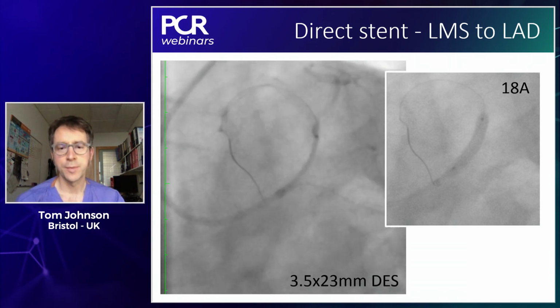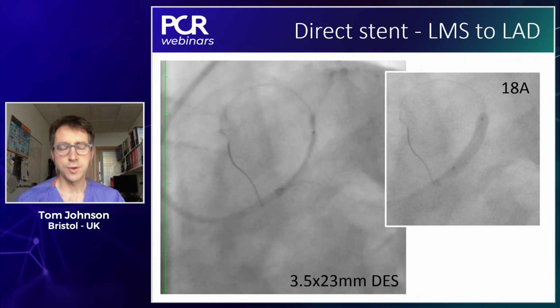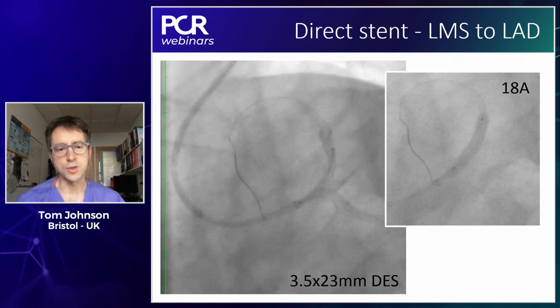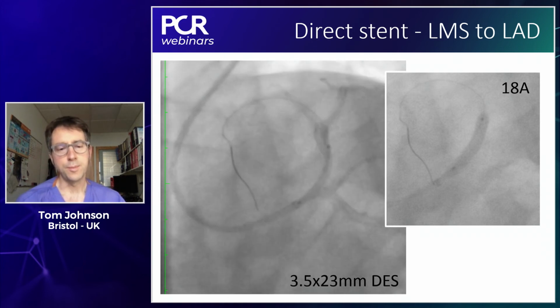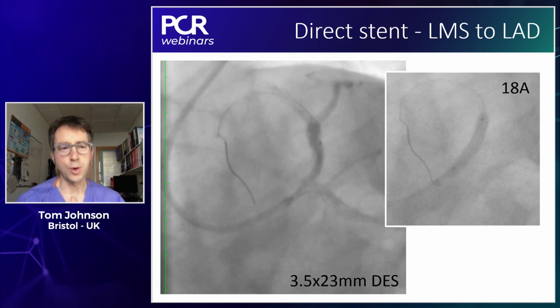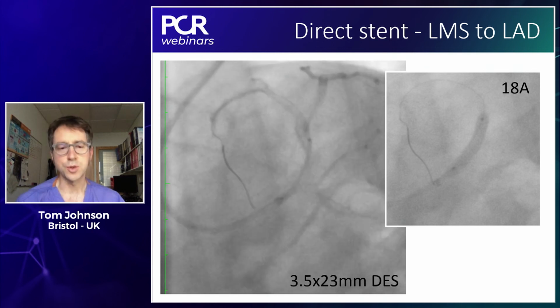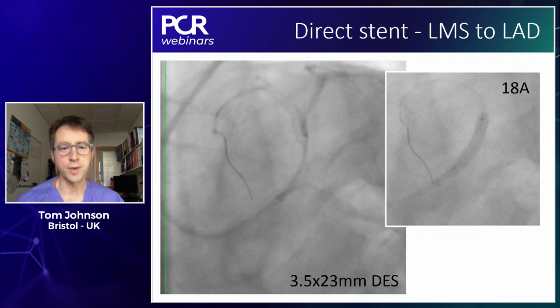in the left main. And so the next step could be disastrous, because aggressive engagement of the guide catheter, passing a very stiff, non-compliant balloon onto the edge of that stent could result in quite significant deformation, and then very great difficulty in then achieving a reasonable result. So absolute care at this point has to be taken. And Goran's already alluded to the visible heart material. That's one of the things that we learn very quickly from that, is quite how much risk there is in us distorting and destroying the beauty of the devices that have been engineered to perfection.